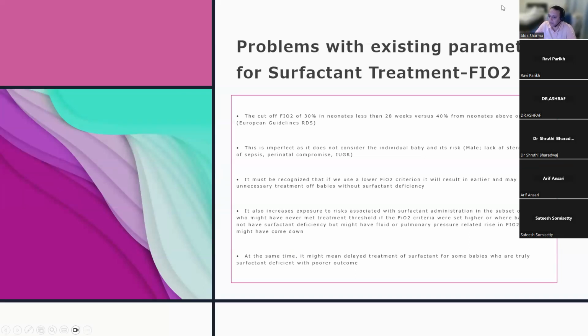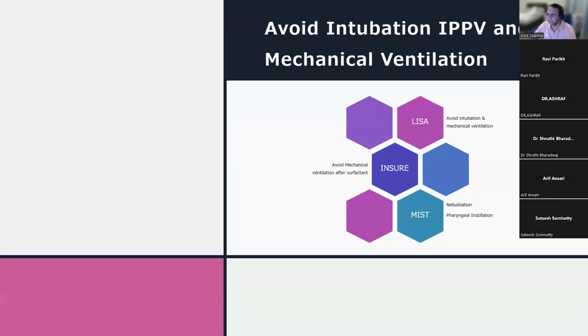Now, naturally, those are babies who might come, and you might make your assessment on the neonatal unit with them having had ineffective recruitment because we've not been able to keep the PEEP. And in those situations, what you're really interpreting in terms of clinical signs and symptoms may not be RDS and surfactant immaturity. It might be just your inability to give PEEP effectively. So unless you're taking all these factors into consideration, clinical parameters would not necessarily always be an accurate marker in isolation of the need for surfactant in these babies.